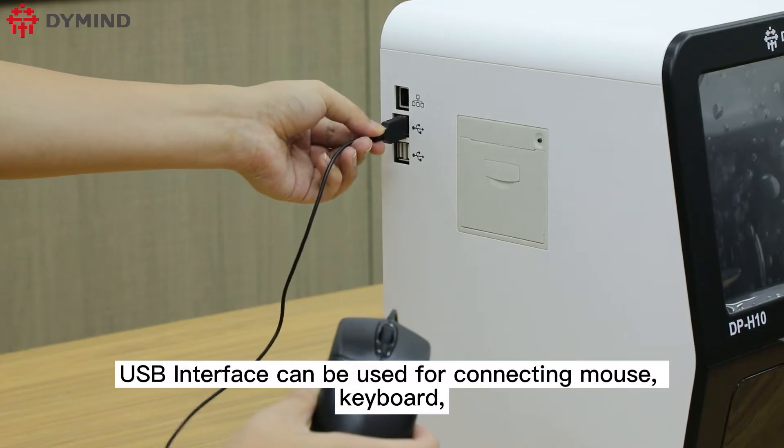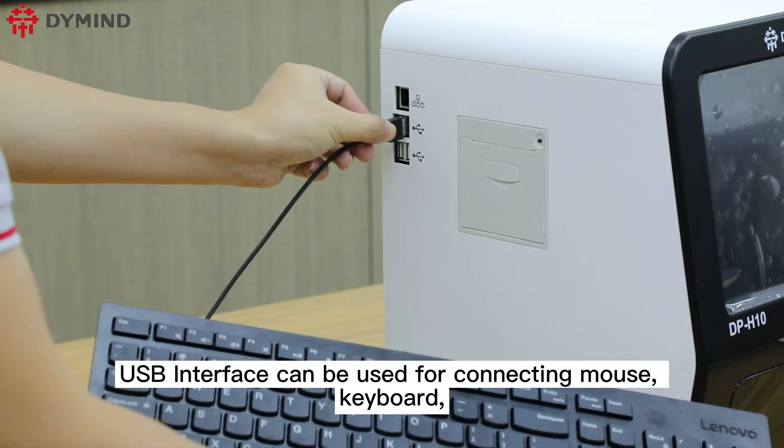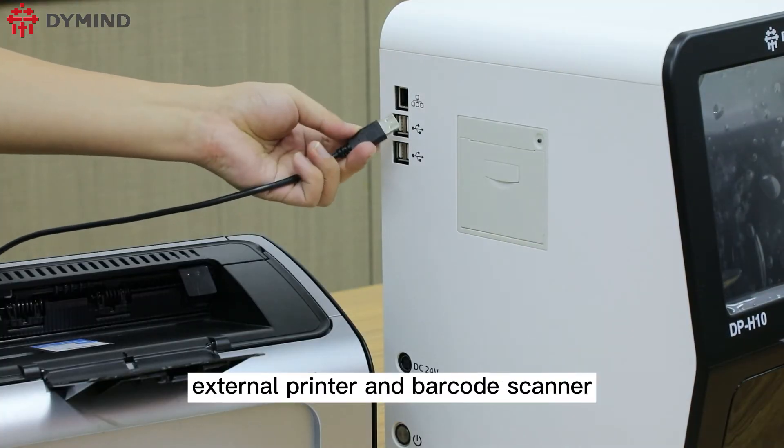The USB interface can be used for connecting a mouse, keyboard, external printer, and barcode scanner.